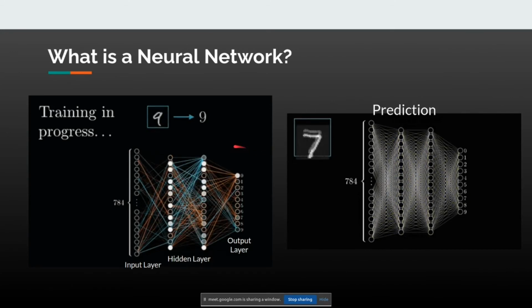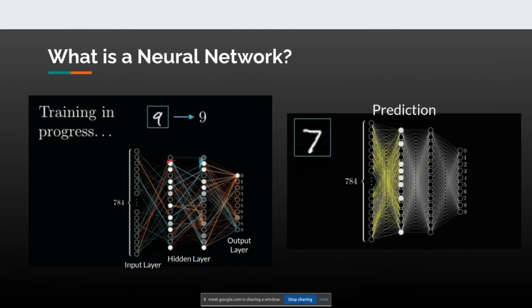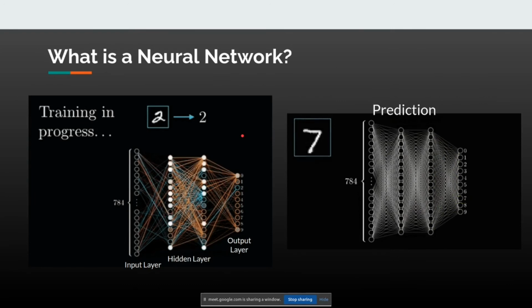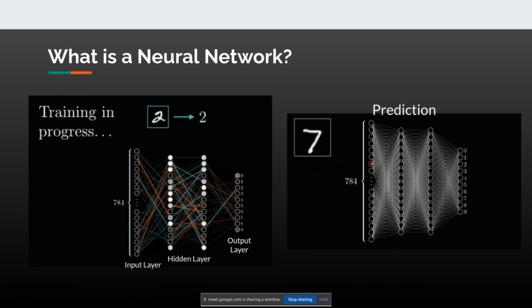During the training phase of the model, the neurons in the hidden layer get activated, which leads us to an answer. During this phase, we calculate the error in the prediction versus the expected value. Our model is then corrected by a process called backpropagation, and this happens for the entire training data set. In the prediction process, we have the image, but we don't know the answer associated with it. So in order to find the answer, we pass the image through our network, and the last layer, the output layer, will predict the results that we want.